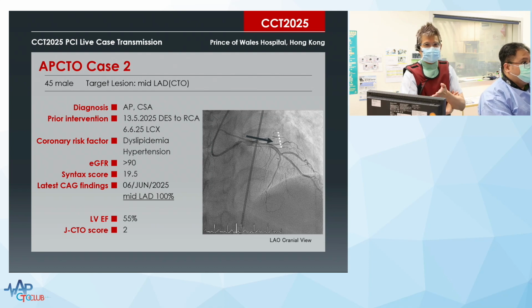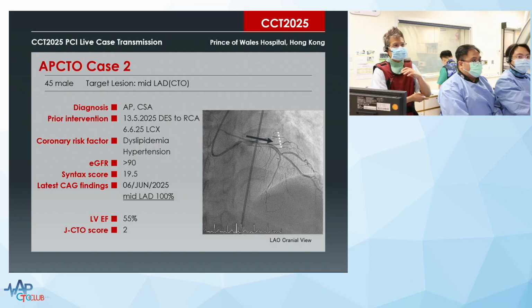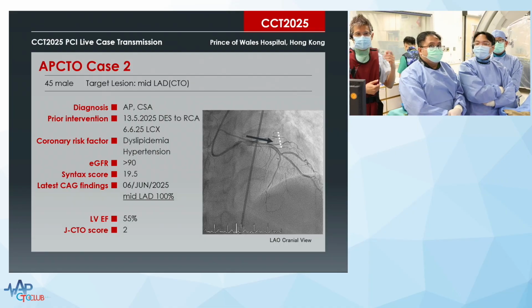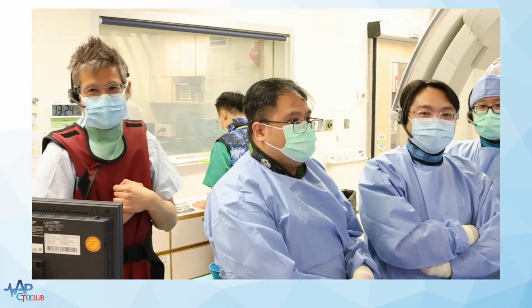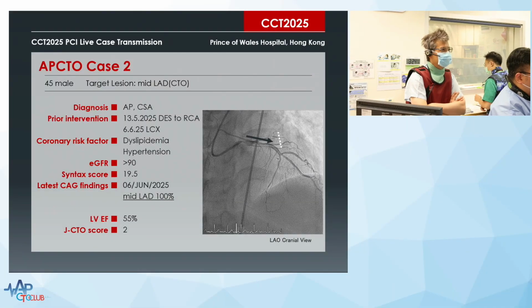So I'm here on the other lab, and I'm with Dr. Karl Chan, who you all know, APCTO, Dr. Chan Yu-ho from COMC, and Dr. Leap from Northern District Hospital. And I think you all know them. They've been APCTO fellows for a very long time. So we have another interesting case on this side, and I'm going to let Dr. Karl Chan present the case for us.